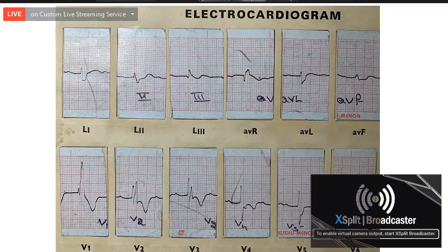Plus 120 degrees. Is it plus or is it minus? Plus only, sir. All the limb leads are almost isoelectric, sir. Lead 1, if at all, but lead 3 is positive, significantly, totally positive. AVR also is positive. Not AVR, AVF. Yes, sir, AVF is positive.